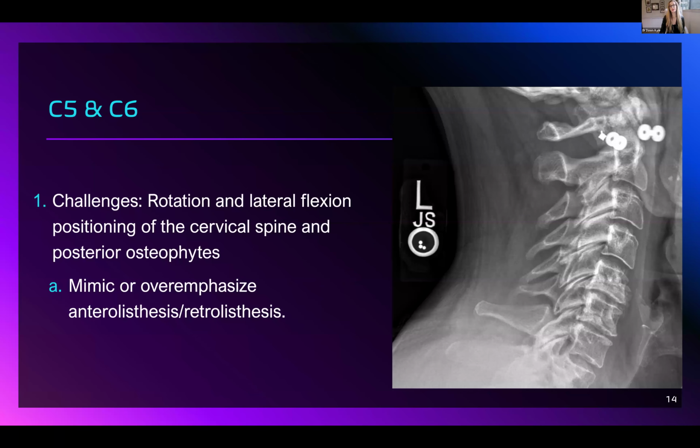And do you have x-rays that come to you without this marking over here, like the left and this little circle with the little dots in there? Can you explain a little bit more what the value of that is? Oh, yes. So this is indicating that the patient is standing. If the little dots were more in the middle and superior within that little circle, that means they're lying down. So they are weight bearing. So we want our x-rays to be weight bearing.